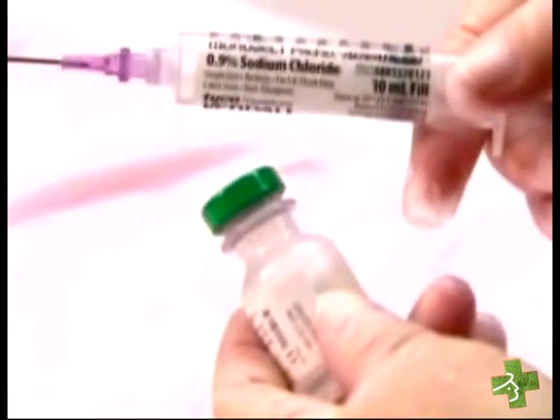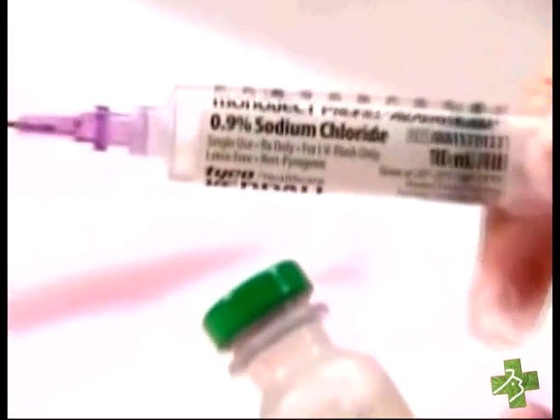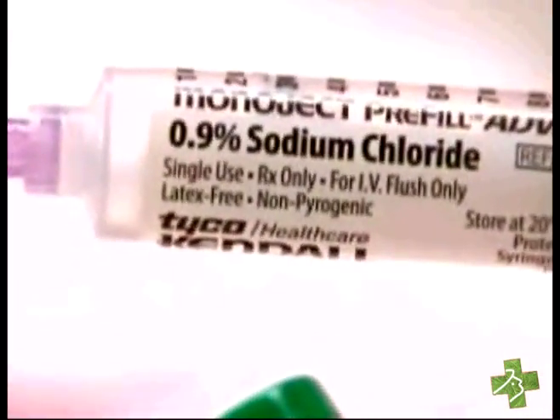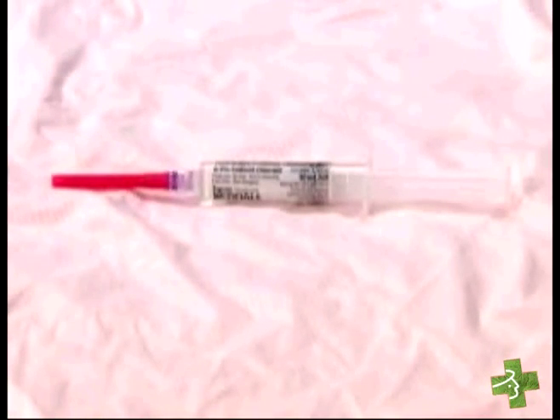This could be an accident waiting to happen. A syringe labeled 0.9% saline flush now contains an additional drug — perhaps even a high alert medication — with no label. If the syringe leaves the preparer's hands before it's used, another practitioner could pick it up and use it on a patient as a saline flush, possibly with lethal consequences.